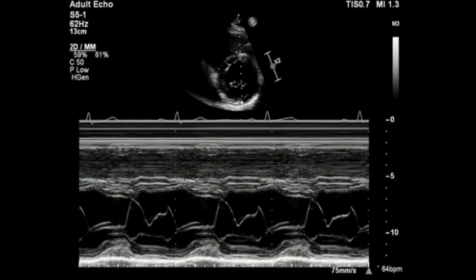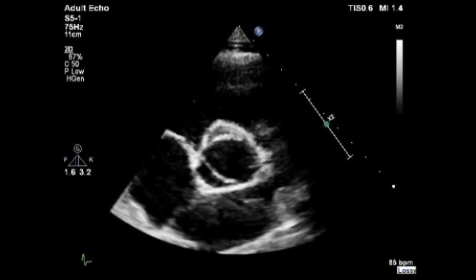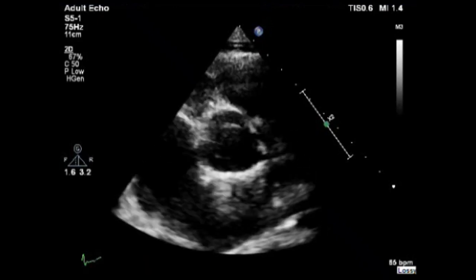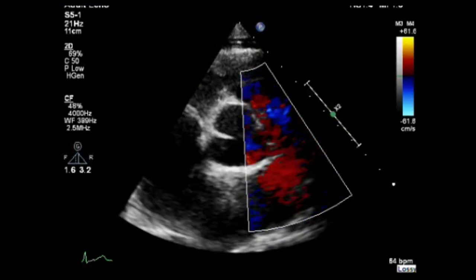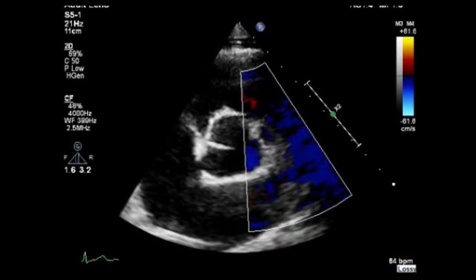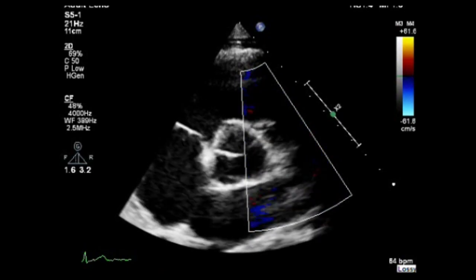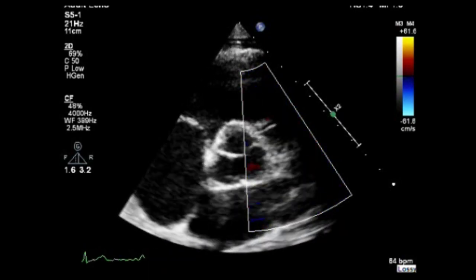Visually assess the mitral valve leaflet excursion and motion. Now let's move to the parasternal short axis view at the great vessels level and carefully visually assess every structure individually. Now place the color Doppler over the pulmonary valve and pulmonary artery and assess the blood flow across the pulmonary valve.